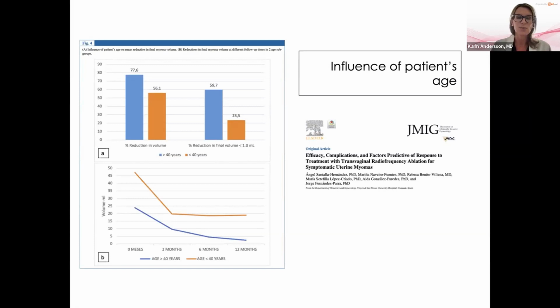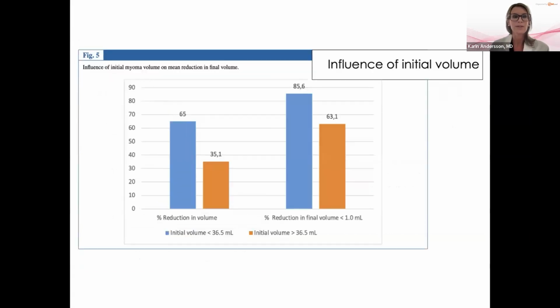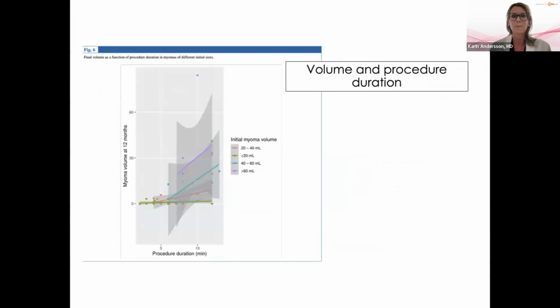This may also depend upon how the fibroid actually is molecularly, because a very stiff and hard fibroid might respond less than a softer and more vascularized fibroid. These are data that we don't have, but we presume this is how it can work. Of course, the influence of the initial volume, as we said, the reduction in volume also is dependent upon how big the fibroid is from the beginning.